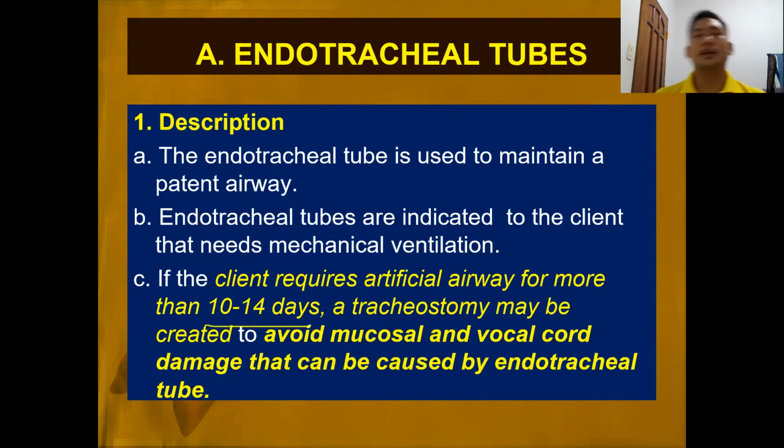So meaning to say, kung sa ICU ka, kasi sa ICU usually nakikita natin to, kapag ang pasyente naka-tube, ninonote nila kailan ininsertan ng pasyente ng endotracheal tube. And kailangan siya mag-due. Kapag 14 days na, 10 to 14 days, the doctor will already talk to the watcher or the significant others na kailangan ng palitan ng tube, kailangan na ng pasyente ng tracheostomy tube, to avoid mucosal and vocal cord damage that can be caused by the endotracheal tube.